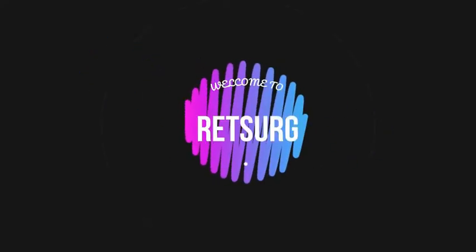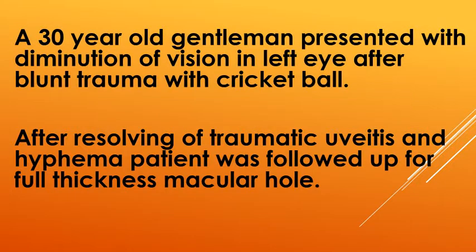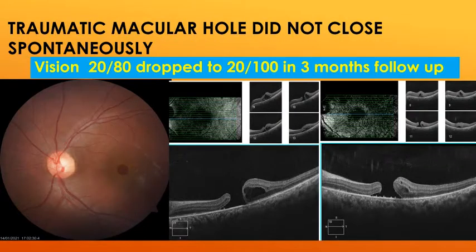This video is about how to manage a complex macular hole. A young man after blunt trauma presented with full thickness macular hole. His pre-operative visual acuity was 20/100. A 23 gauge pars plana vitrectomy with internal limiting peeling and gas was planned.